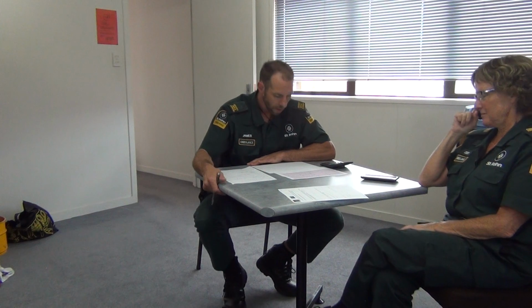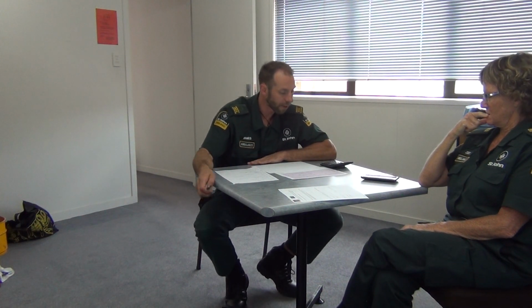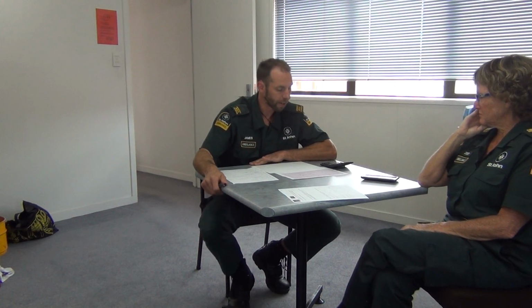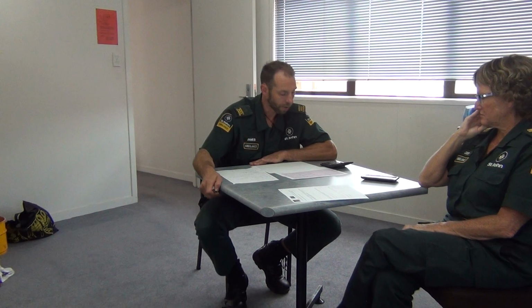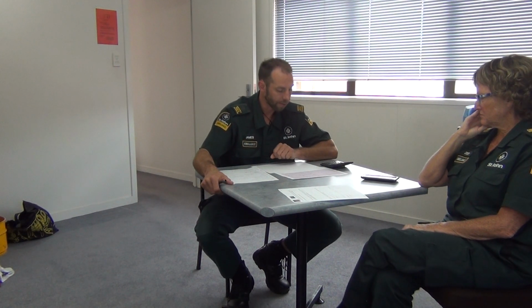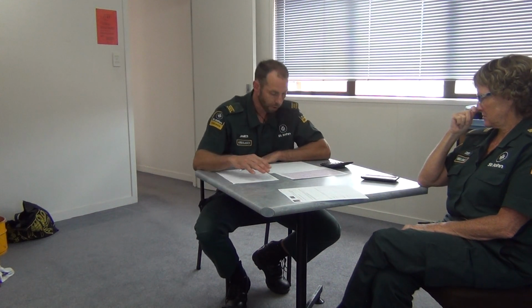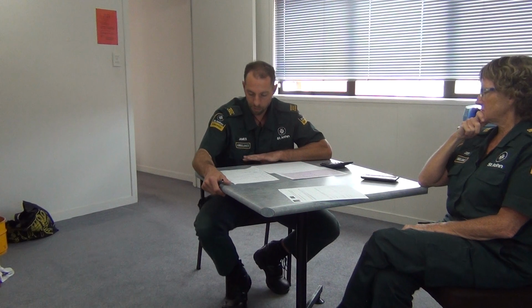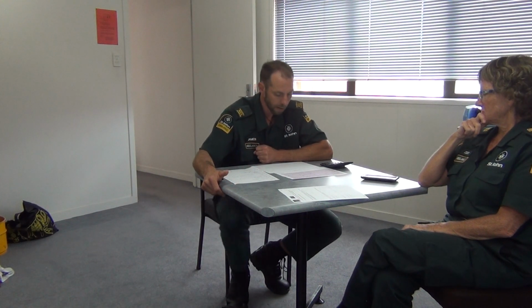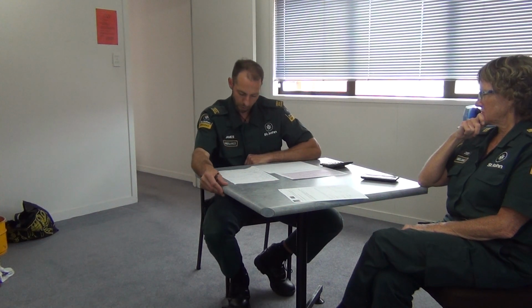You've got 1 more minute to go. Okay, yes, for me there's an inferior STEMI, involving 2, 3 and AVF with reciprocal changes in AVL. This also fits with the patient's presentation of having crushing chest pain with the collapse, the vomiting. Yeah, just make sure I've covered everything.